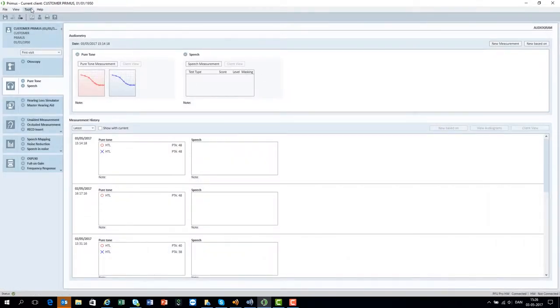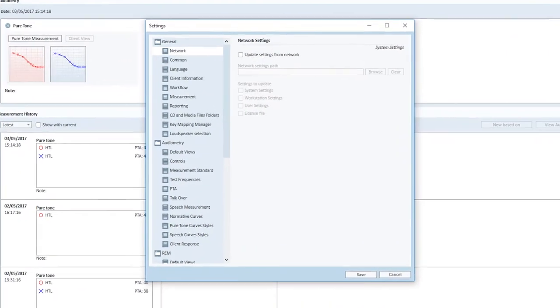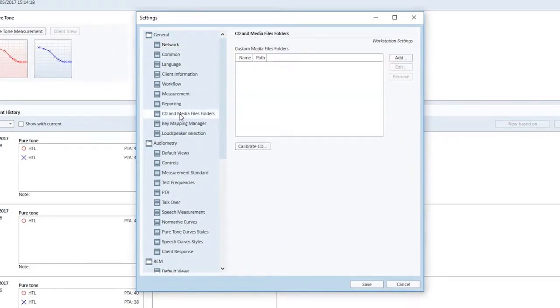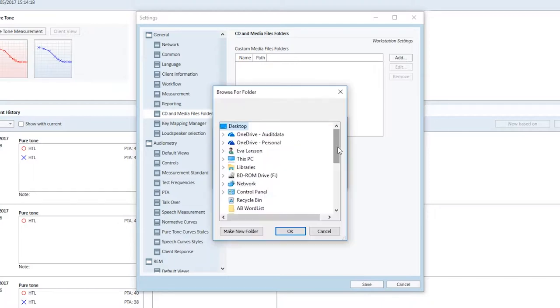In order to install speech material, go to tools and then settings. Under general settings, select CD and media files folders where you can add wave files or CDs. If you use wave files, locate the sound files in your computer and add them to Primus.